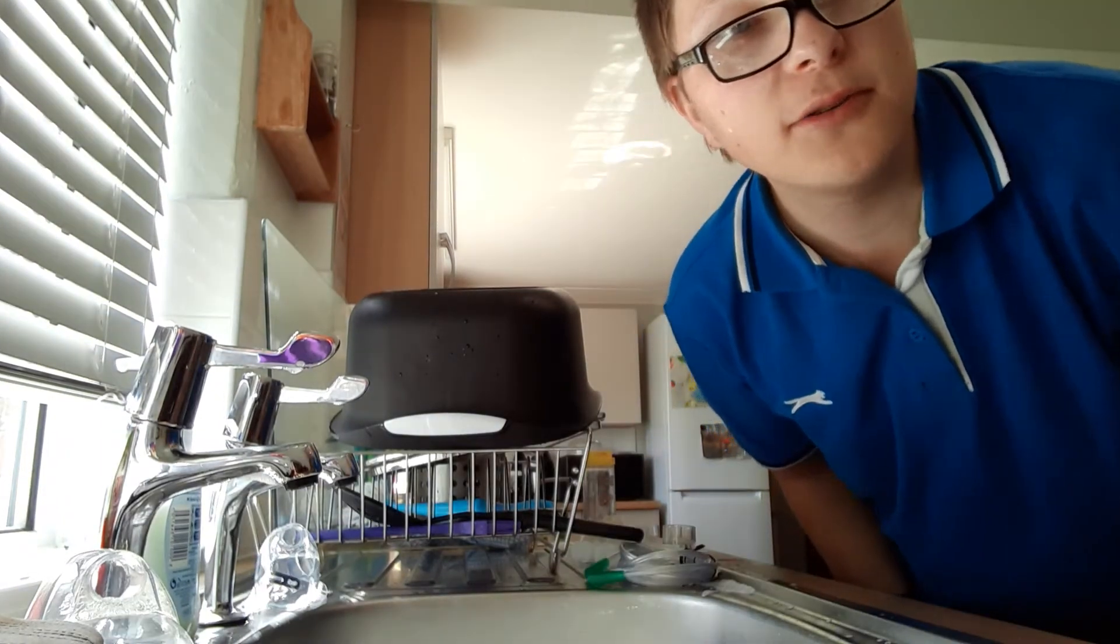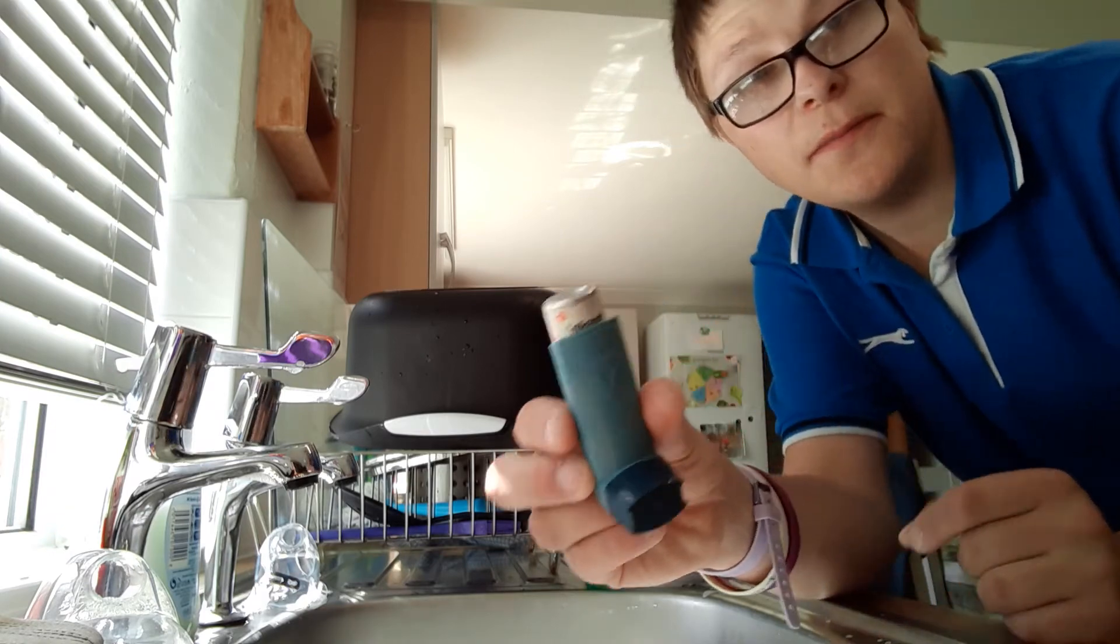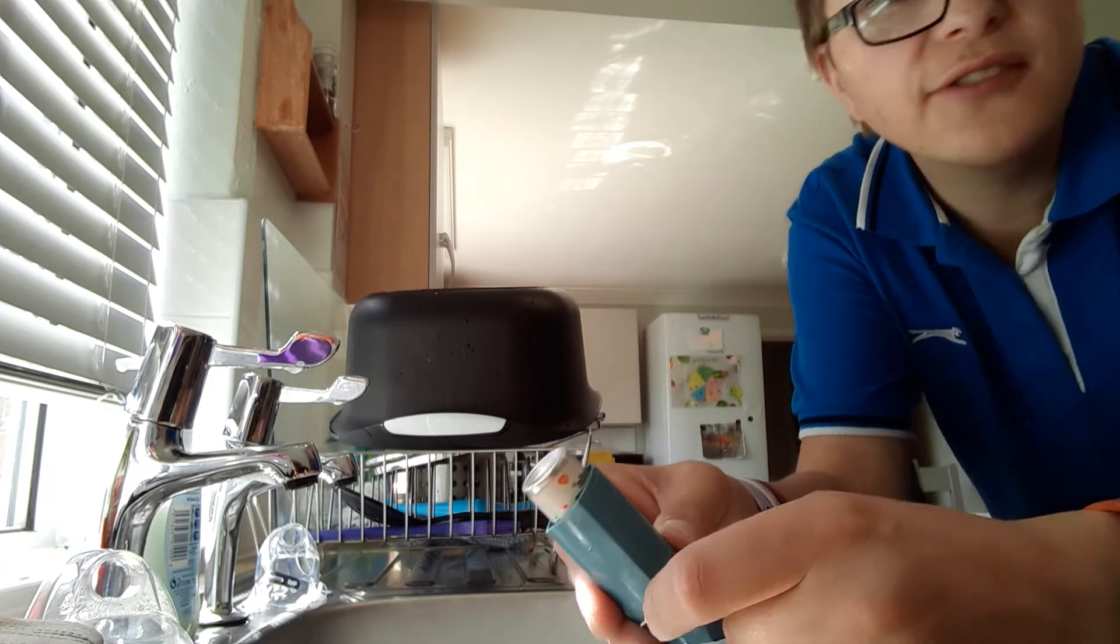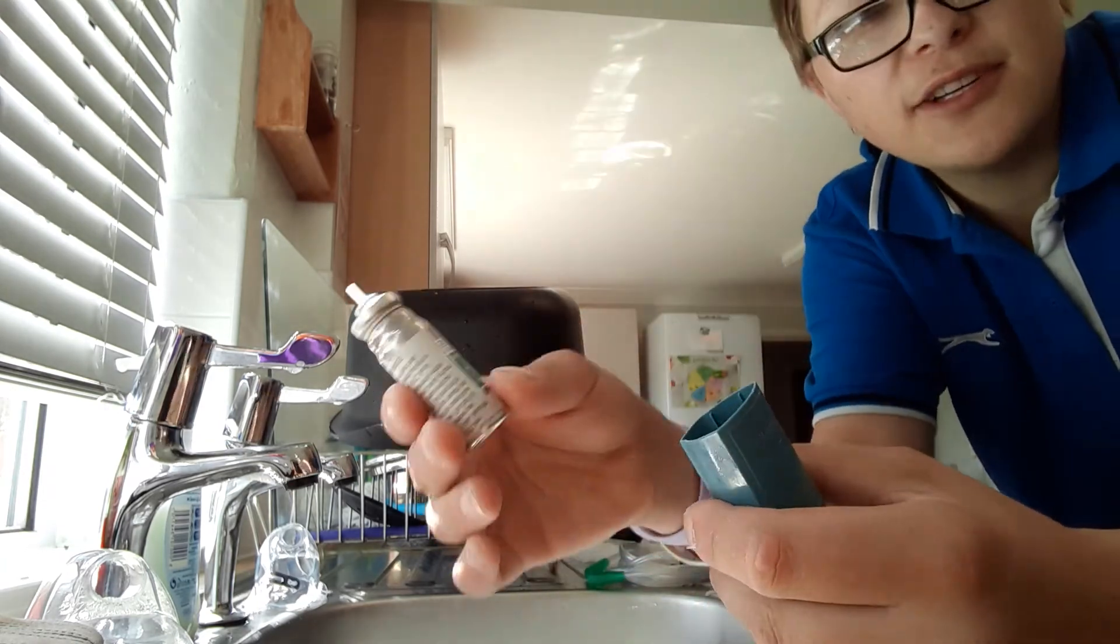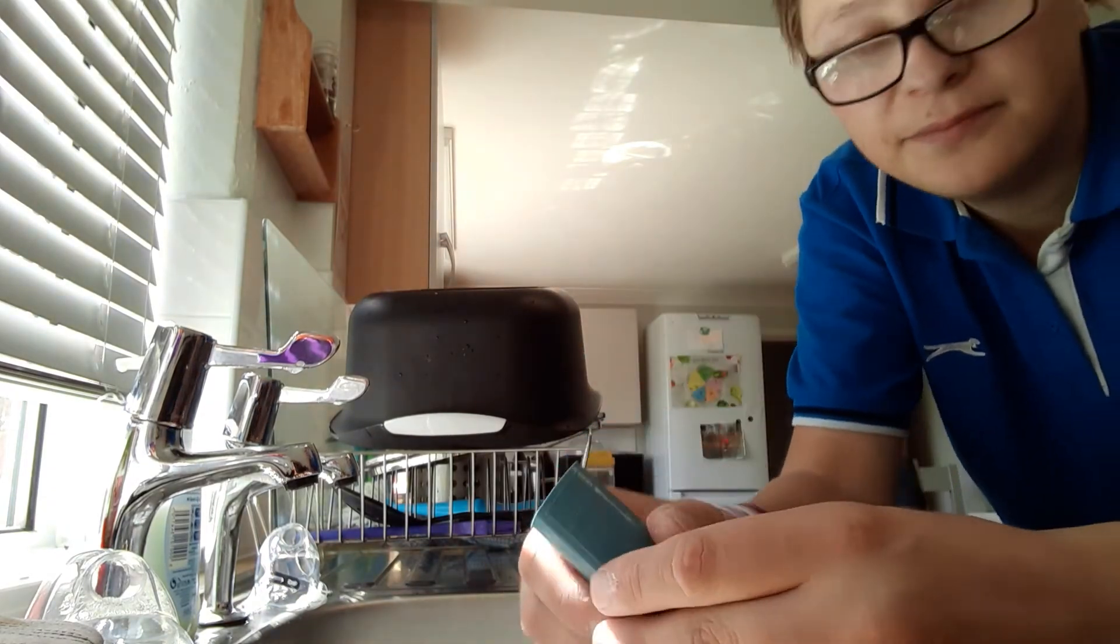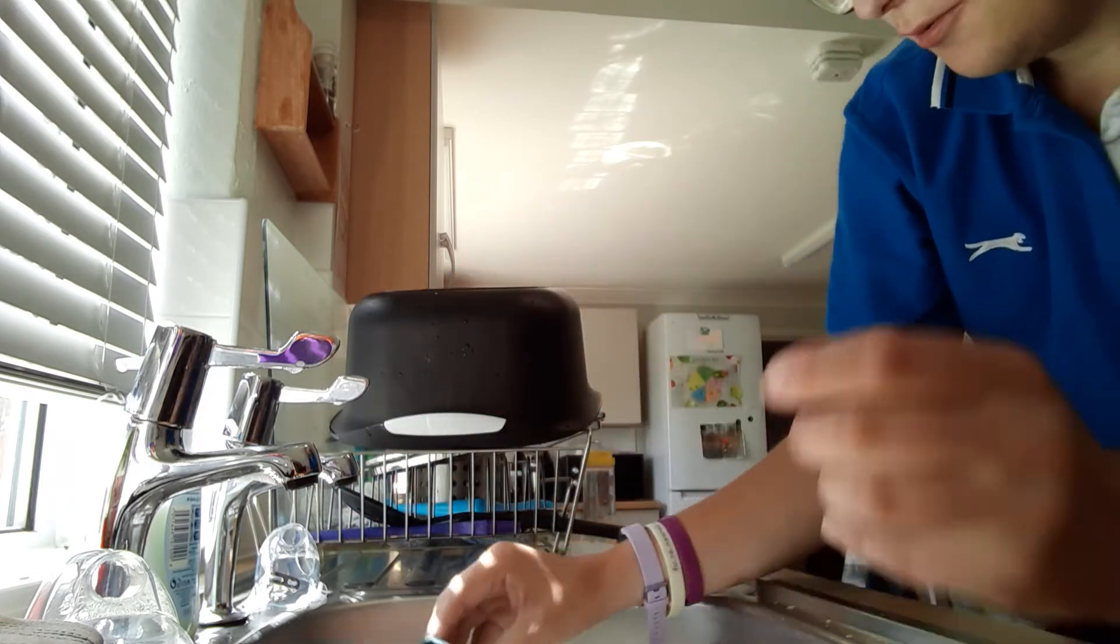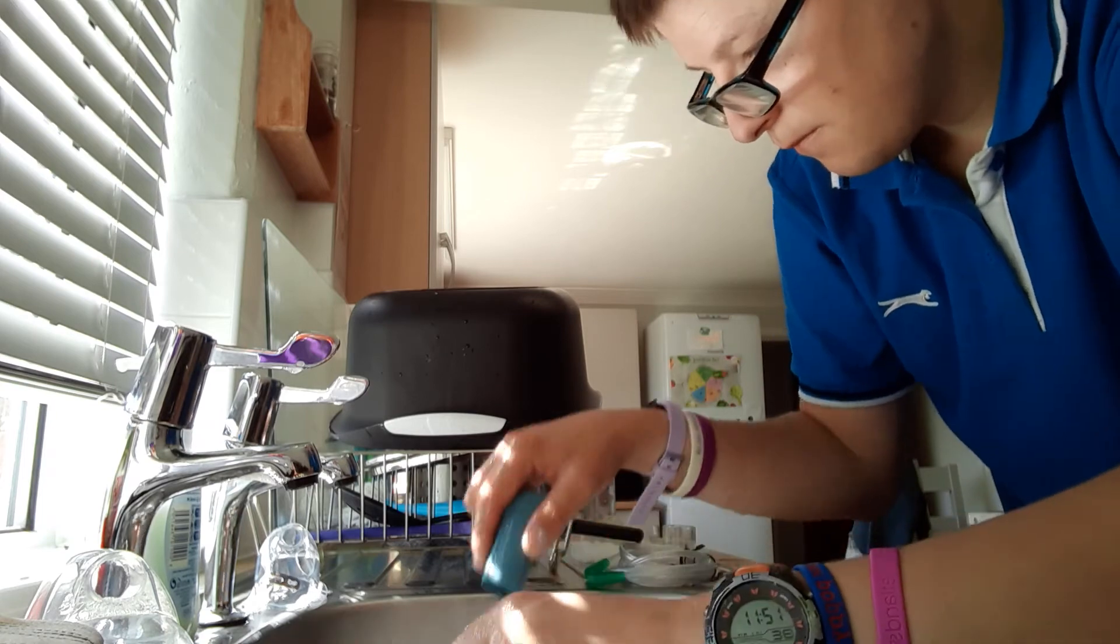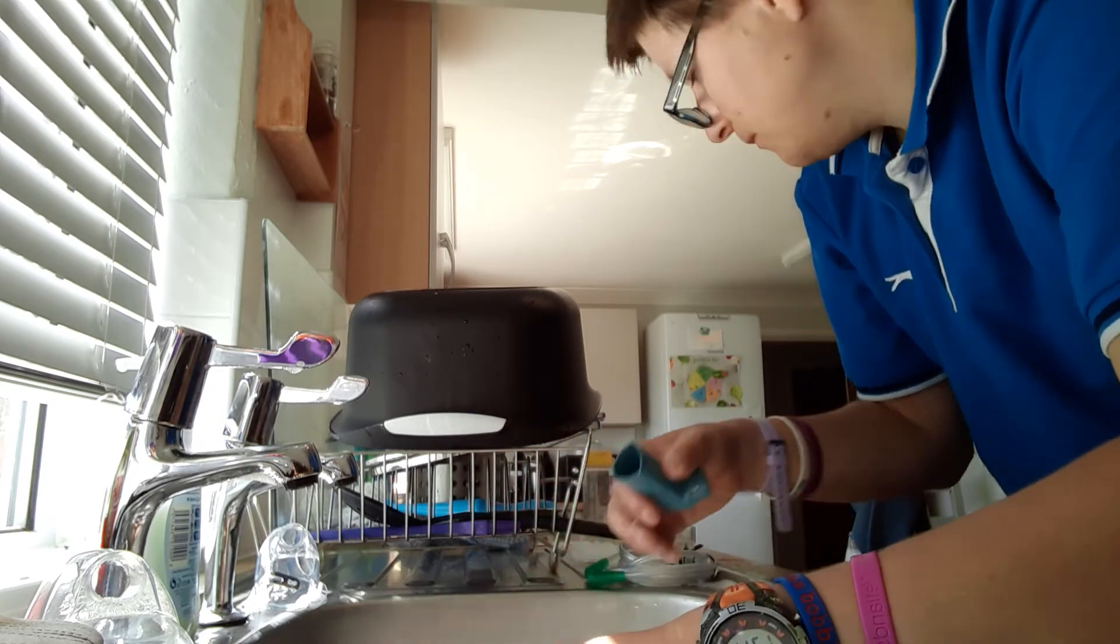And also, here is a green Ventolin inhaler. I'm going to show you how to clean it. You take that out, and you should clean it once a week. Then you clean that in warm, soapy water as well.